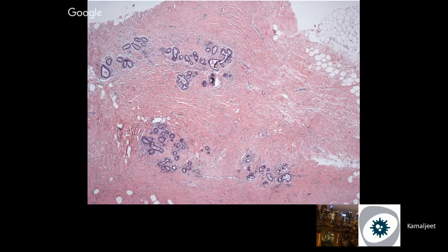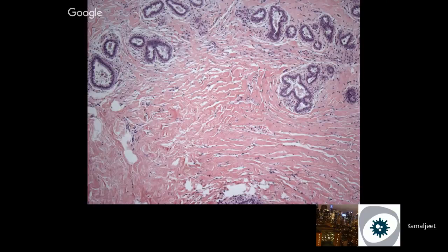PASH, typically the findings are very typical. They look like gynecomastoid, but you have to focus on the stroma. In the stroma, you'll find these pseudovascular spaces with nuclei hanging onto the edge. And if you look at the PASH under frozen, they're actually supposed to be filled with some matrix mucin, and during processing, it gets washed off. So that's the PASH.